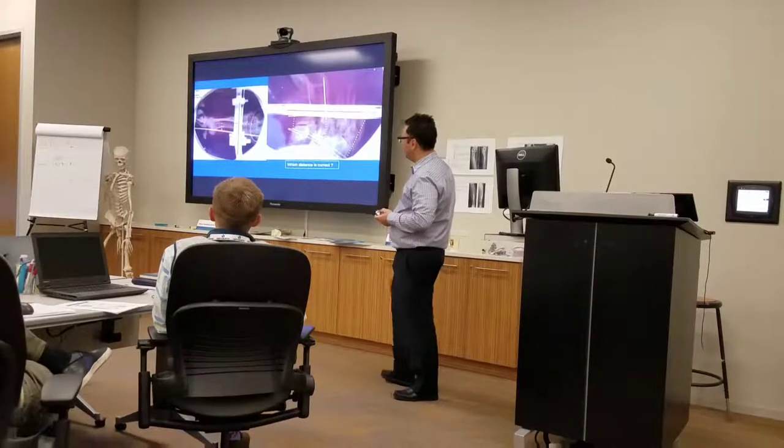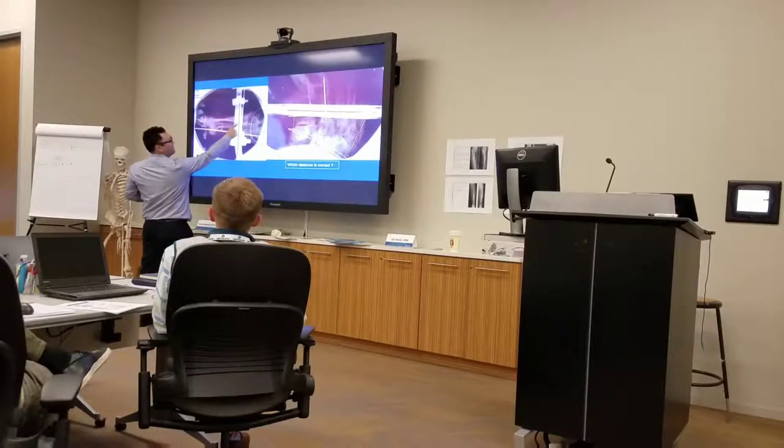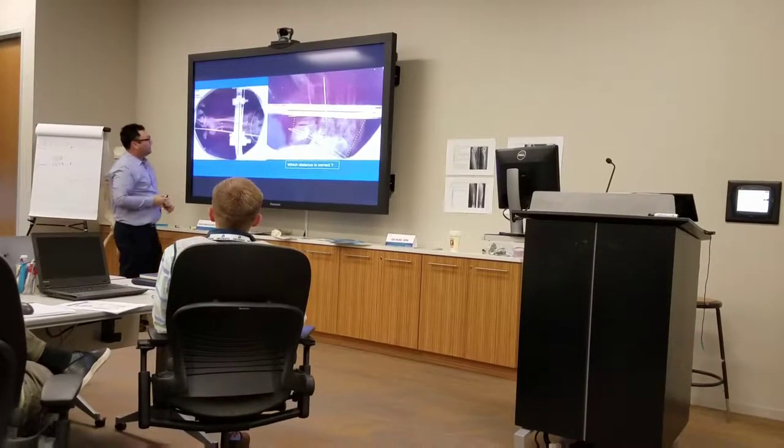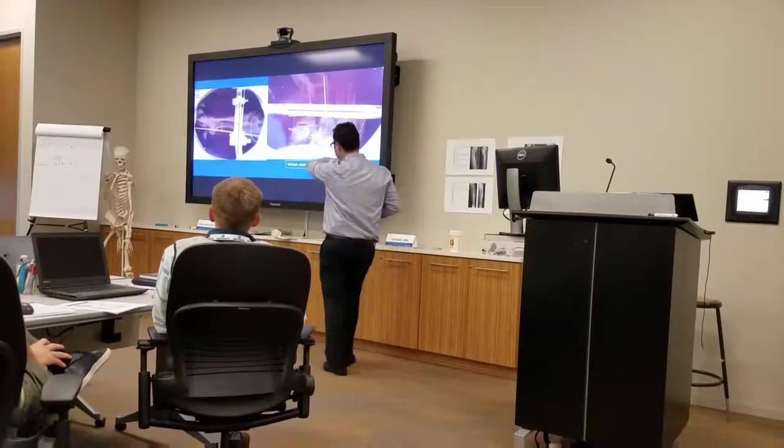So here we go again. Once again, I can easily measure the frame to where the osteotomy was, so I know I have an exact amount. As well, from here, from the center of the frame to the osteotomy.